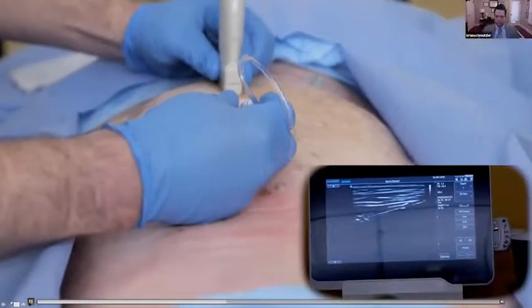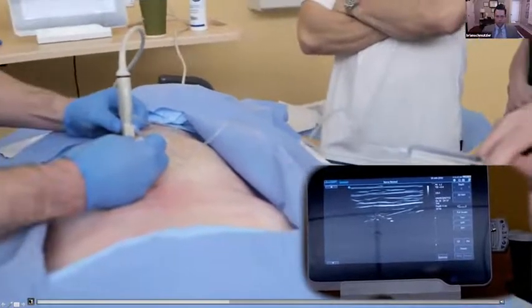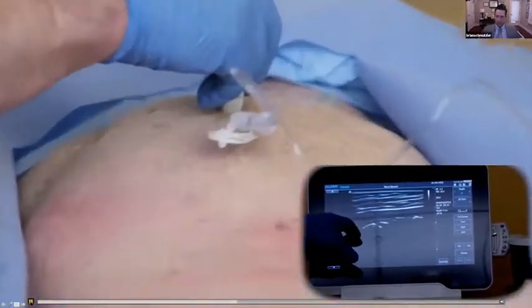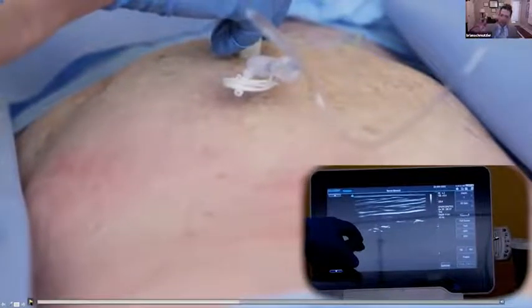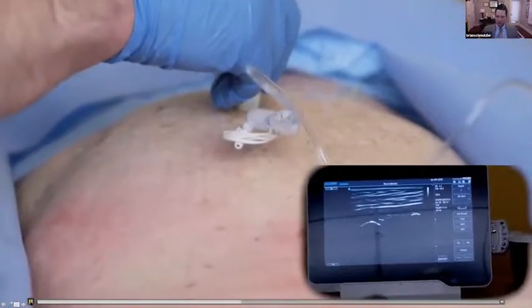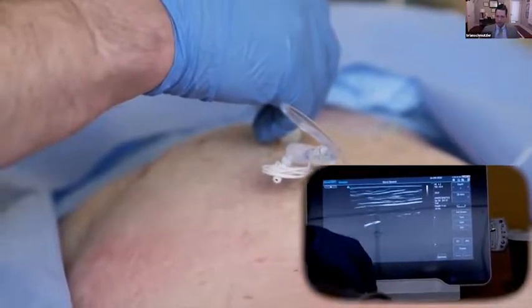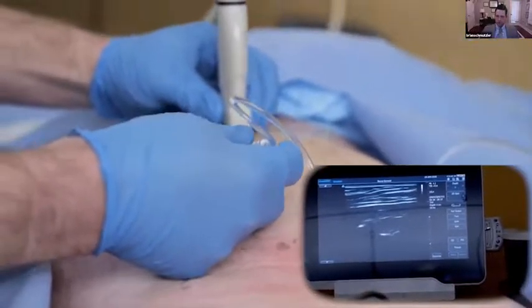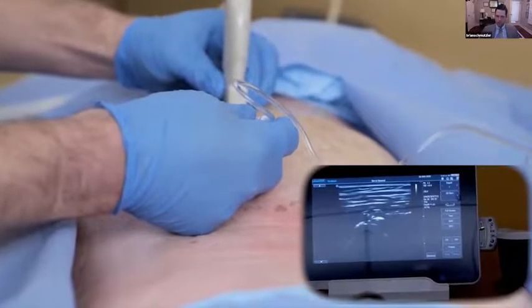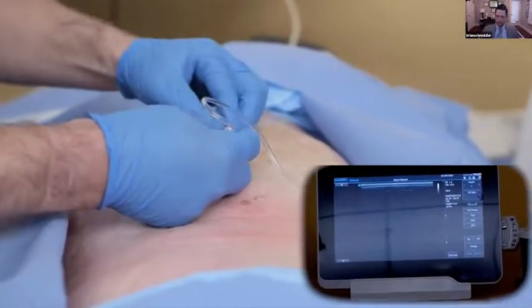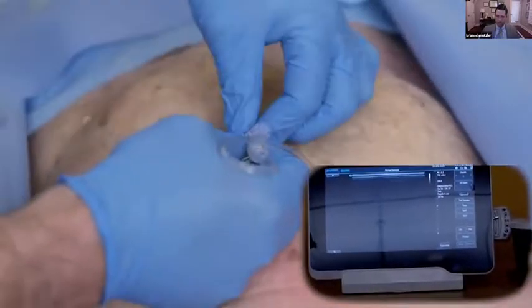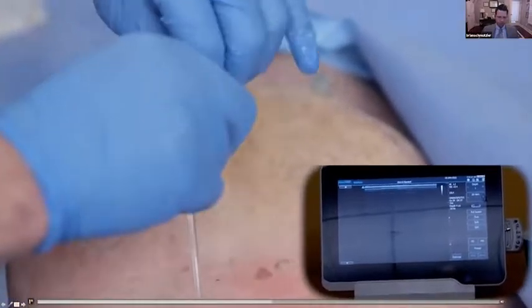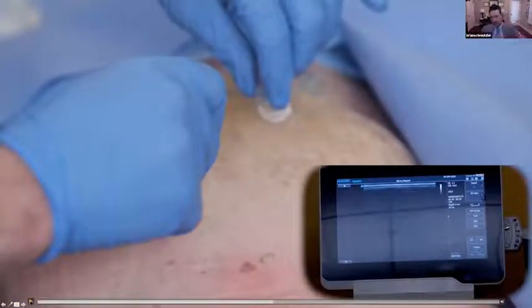Go ahead and inject. You can see it peeling that muscle off — that's what you want to see. The bone is coming down and the muscle is peeling up, which looks really nice. Keep going — see it peel that muscle right off. Then I'll drop the probe, thread the catheter in, and Seldinger-technique it off until it's hooked. You'll be able to see nicely that the catheter stayed right in the erector spinae plane.